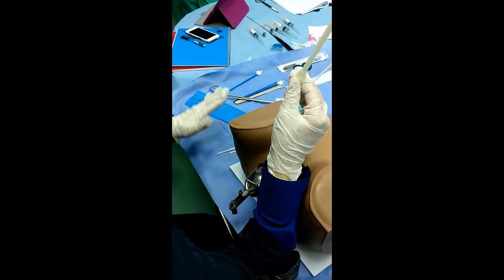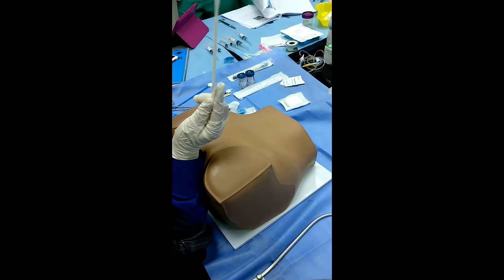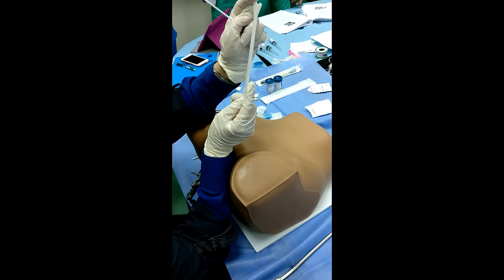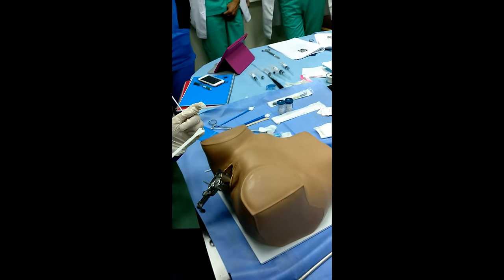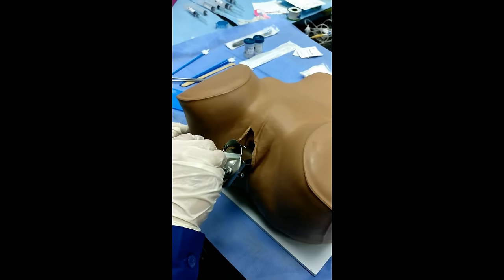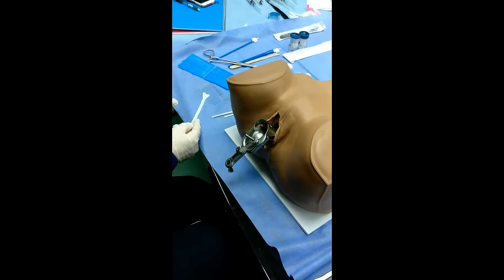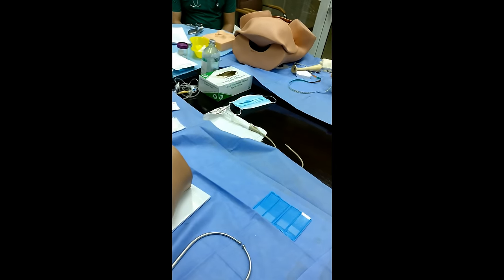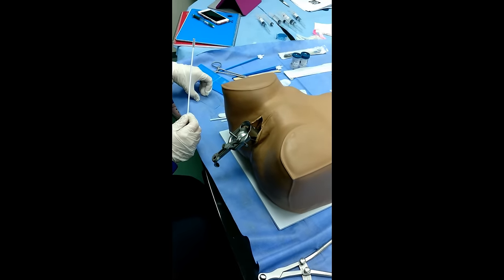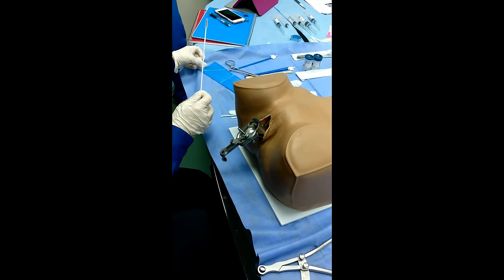The first instrument is to collect the material from the ectocervix. The longer end is inserted into the cervical canal, the shorter on the ectocervix. You insert it and rotate it 360 degrees. You apply it on the slide and fix it, simulating the fixation. You label the glass immediately with the name of the patient, from the material from the ectocervix.